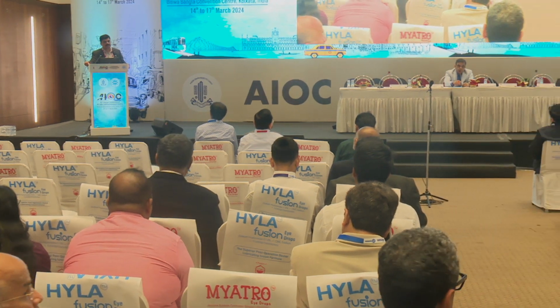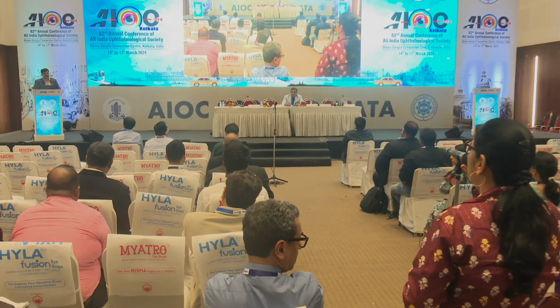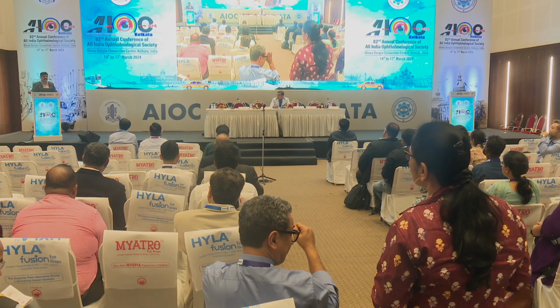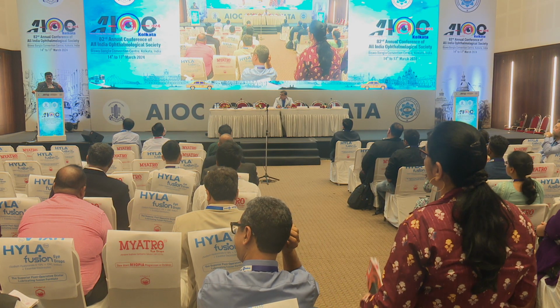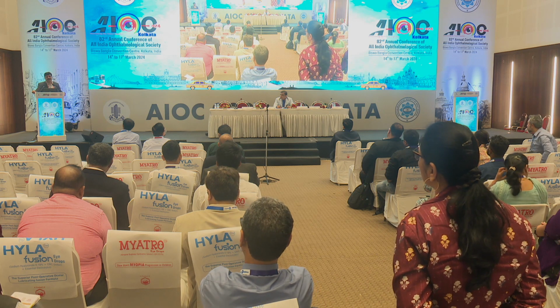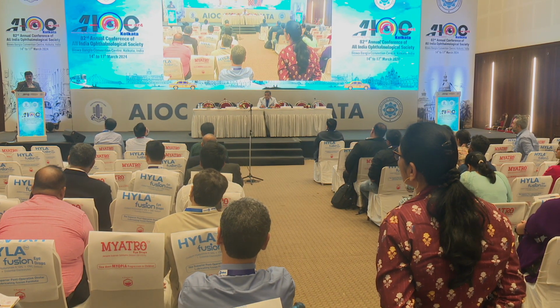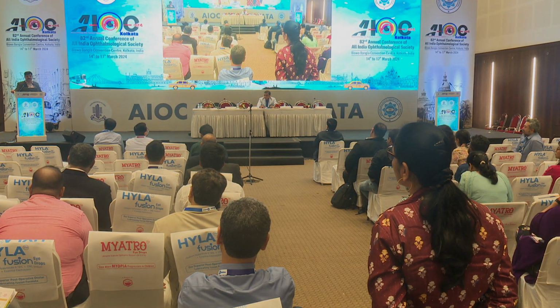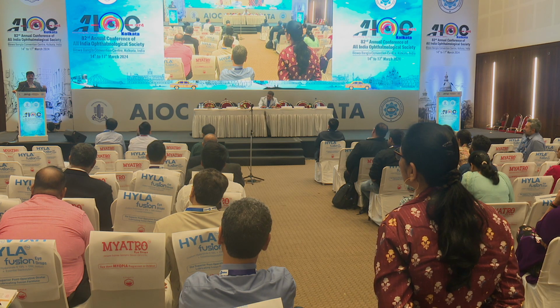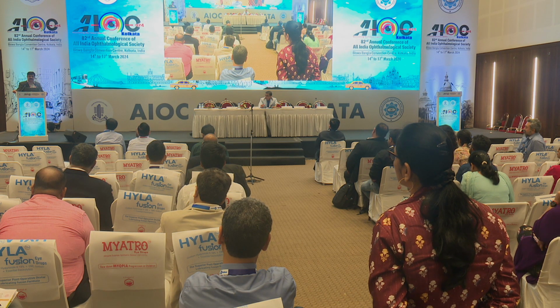How long does it take the PRK haze to disappear, sir? PRK haze, again depending upon the patients, normally it resolves by around 3 months. If you put them on aggressive steroids, it can disappear quickly also, but you need to know about the complications of steroid use also. If you aggressively put them on prednisolone, like start with 4 times for a week, then tapering, even I have seen patients within 1 month they regress.